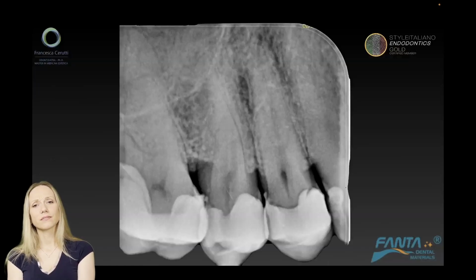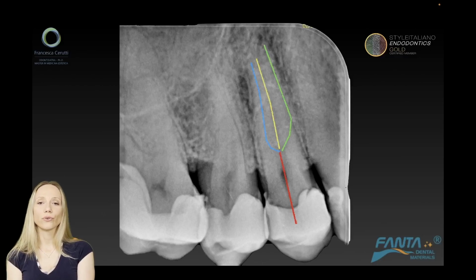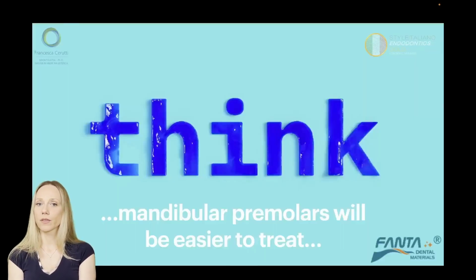And this, you can see that I see a root canal, and then 1, 2, and 3. This is a rare occurrence, but if I see this in my preoperative radiography, I have to change completely my approach to the root canal treatment, because I have to change my access cavity, the shaping, the cleaning, the filling procedure.